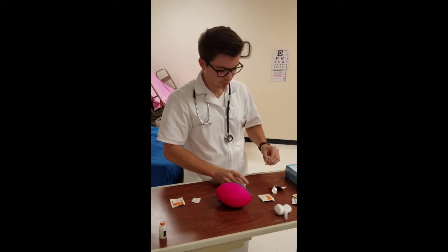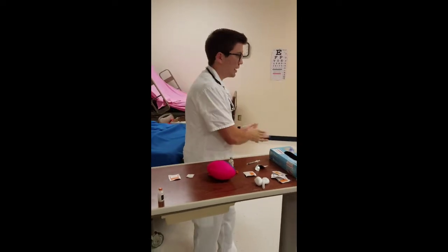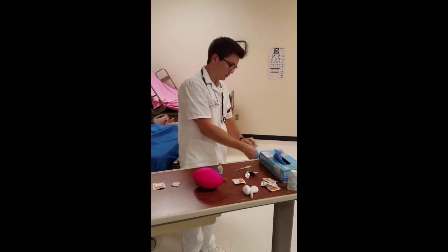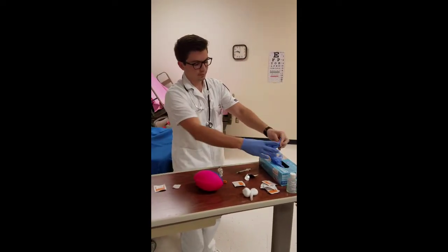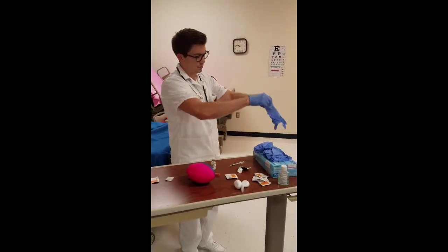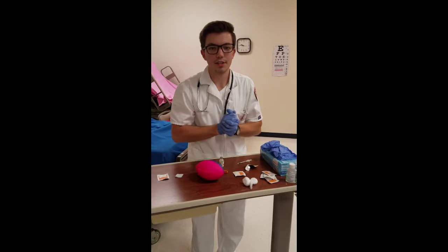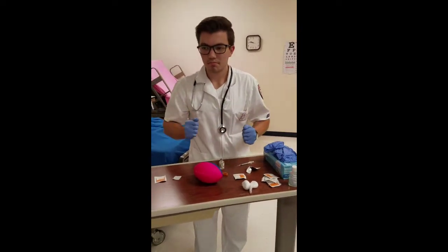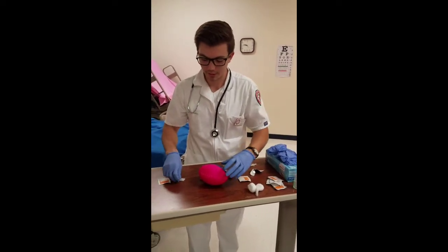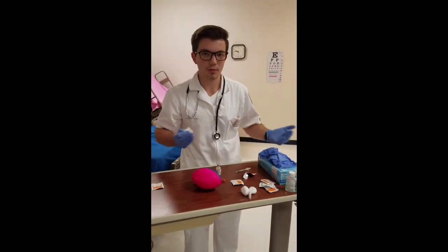So, now, we're going to get ready to actually give the insulin to the patient. You do hand hygiene. You go ahead and put on gloves. You're going to want to choose your site for this activity. We're going to say that the patient wants it in their abdomen, so we're going to give it in the abdomen. You're going to want to find out if it was given in the abdomen, which side it was given, because you're going to want to rotate sites.